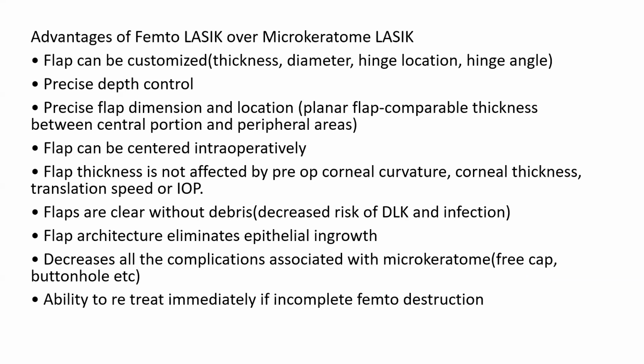Coming to a few advantages of femto LASIK over microkeratome LASIK is that the flap can be customized. That is the thickness, diameter, hinge location, and hinge angle. We have precise depth control and precise flap dimension and locations. Flap can be centered intraoperatively in femto LASIK, and the flap thickness is not affected by the pre-op corneal curvature, thickness, or translational speed or IOP.